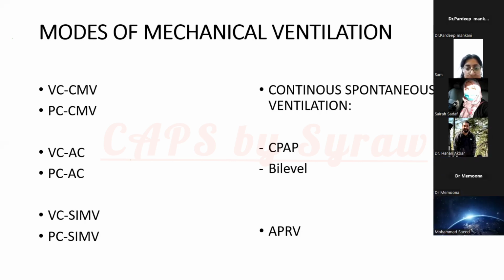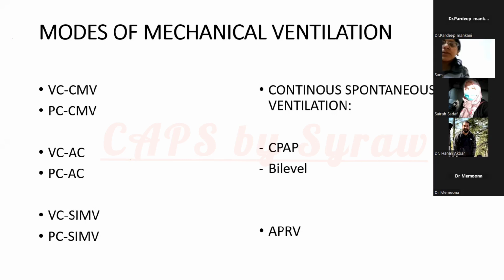Okay, so this is kind of a new mode. It is a smart mode. You could say it is a hybrid mode. I've already told you that a ventilator mode can only use either the volume control or pressure control mode at a single time. But this is a hybrid mode. It is an intelligent mode which could use the properties of both.